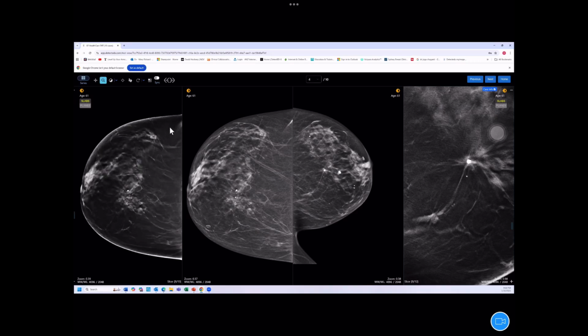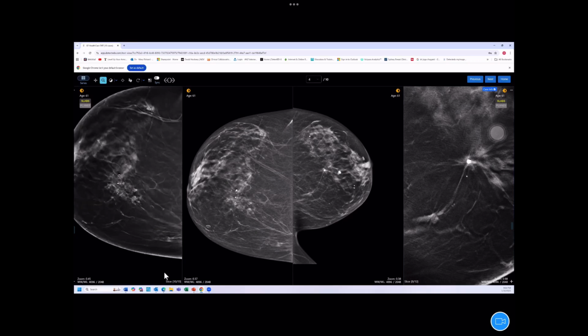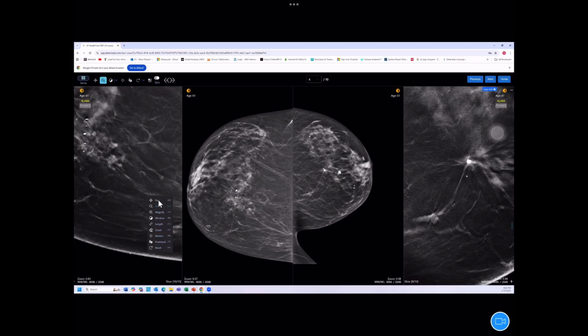Now, I want to just highlight the other side. Were we to scroll through the other side, I guess all this pattern looks pretty normal. Now, she has an area here where there's quite clearly disruption of the normal pattern, but it looks like it probably is benign fibrocystic type change. It's rather nodular and a little bit contracted, and it's got some calcs. But what is a bit different, and what does again come into play much more clearly on this particular tomographic slice, is this change down here.